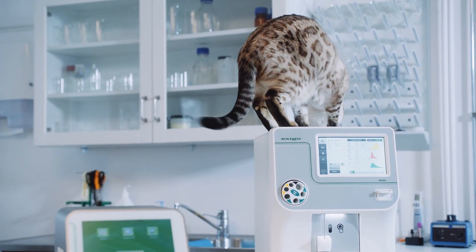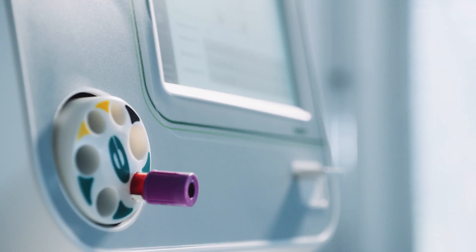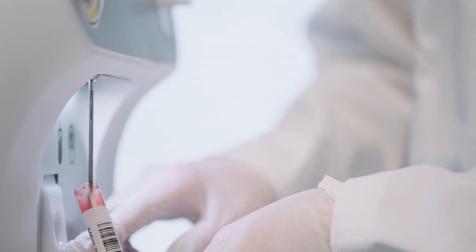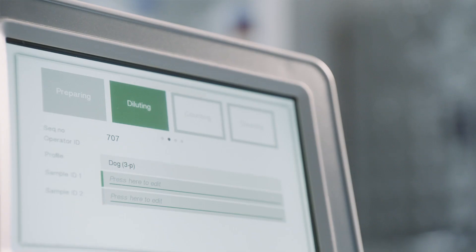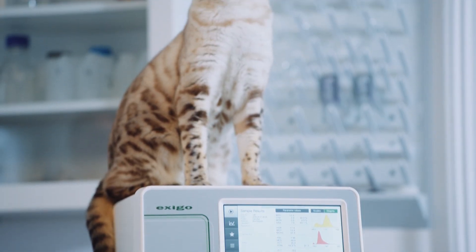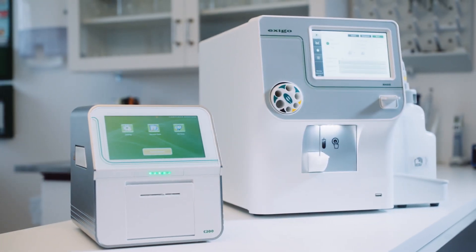To summarize, Exego H400 Hematology Analyzer combines high levels of innovative technology with outstanding performance, accuracy, and quality. It is easy to operate, and the different sampling options let you use the method that best fits your laboratory needs. You won't find a better four-part differential veterinary hematology analyzer anywhere else today. Sampling and analyzing patients should be simple and effective.